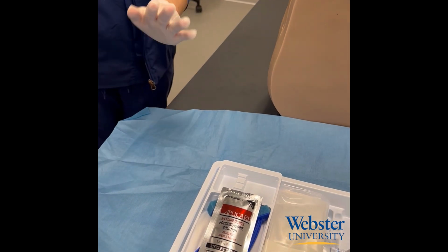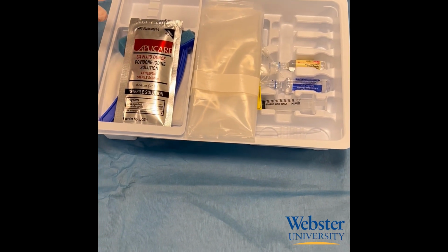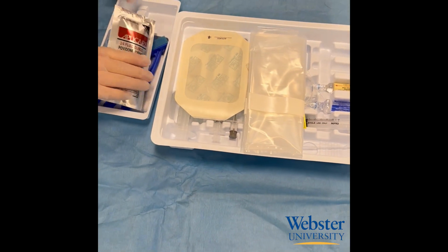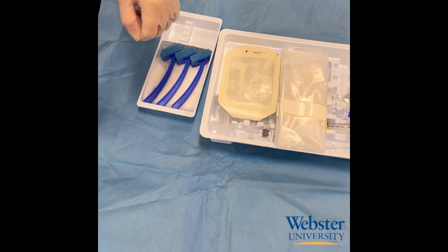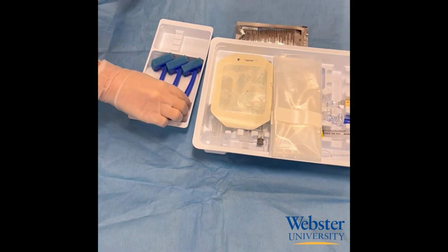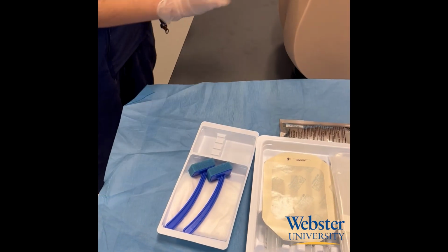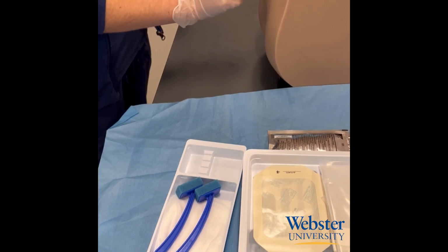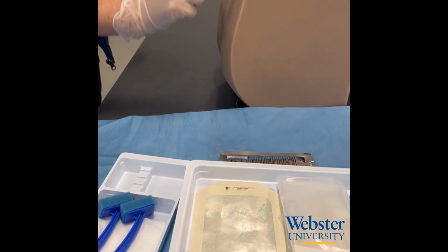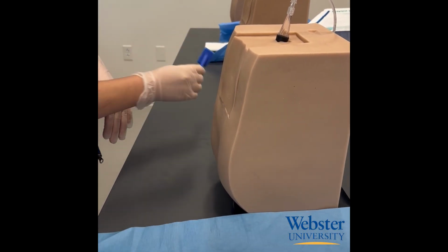My sterile gloves. First, I want to clean the site, so I'm going to open up my betadine and empty it into the tray. To clean my site, I'm going to start at the injection site and scrub it well and work my way out in concentric circles, throwing away the used swab and grabbing the next.